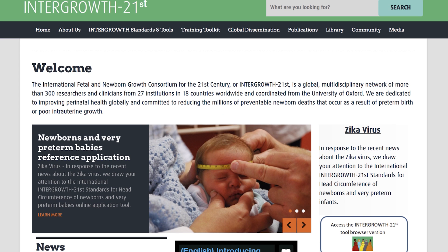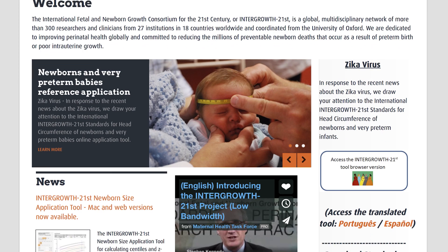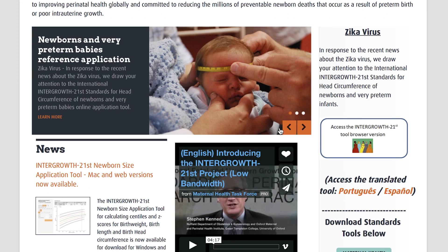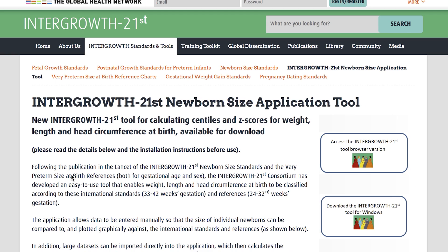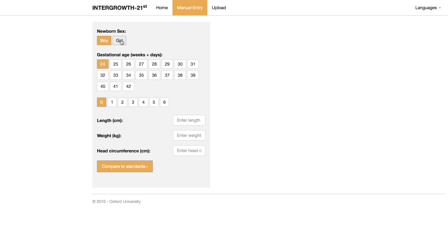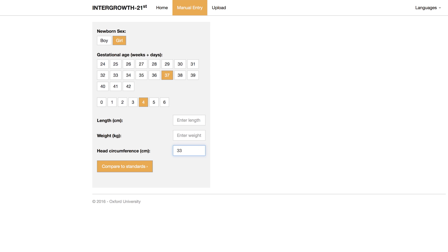Once you have the measurements, open the Intergrowth 21st newborn size application tool, which is freely accessible to download, or alternatively you can use the browser version. First, enter the sex, then the gestational age in weeks and days to the best of your knowledge from the information available. Next, enter some or all of the required measurements. The head circumference measurement we took earlier was 33.3, so enter 33.3, or 33,3, depending on which country you are in.